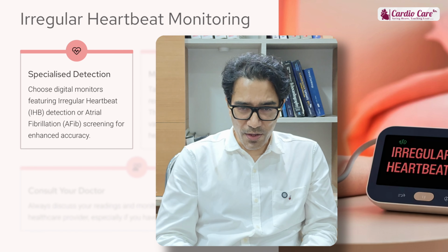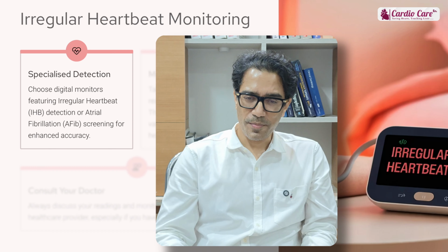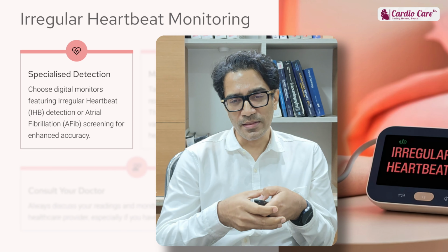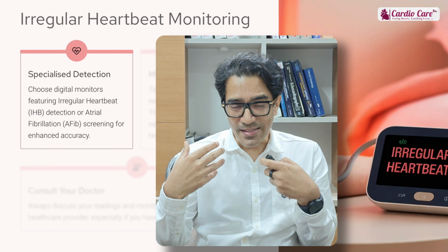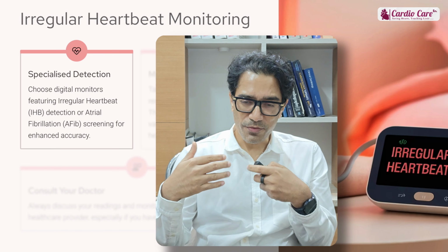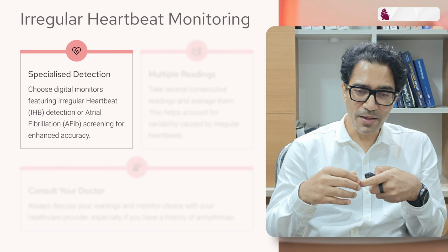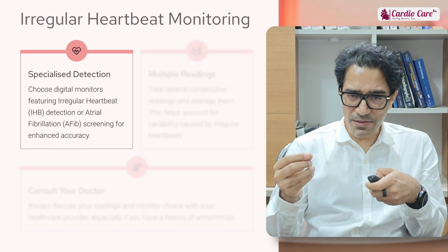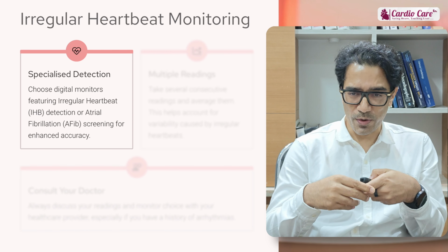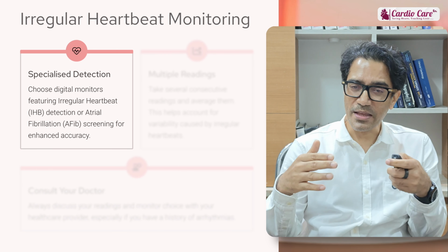Especially in case of irregular heartbeat, few patients, especially our senior citizens, tend to have an irregular heart rate because of atrial fibrillation or multiple ectopics. In this irregular heart rate, digital monitoring could be quite inaccurate. So in case of irregular heart rate, it is better to go for a manual BP measurement through either Mercury or Aneroid variety. There are specific digital monitors which are designed for irregular heart rate, but as such, digital monitors are inaccurate if somebody is having an irregular heart rate.